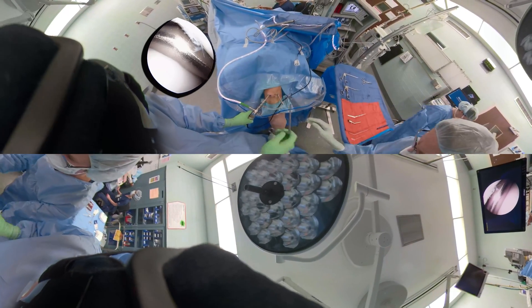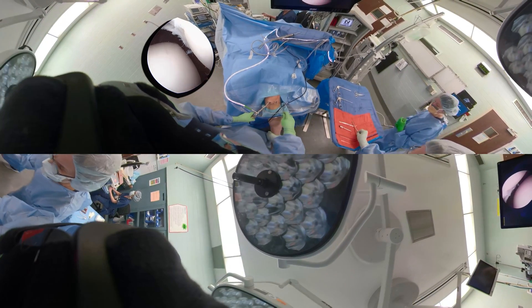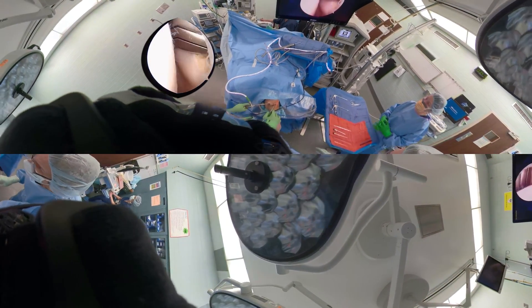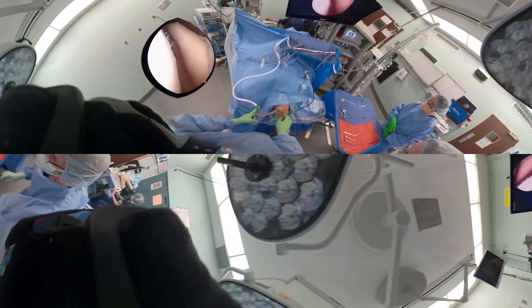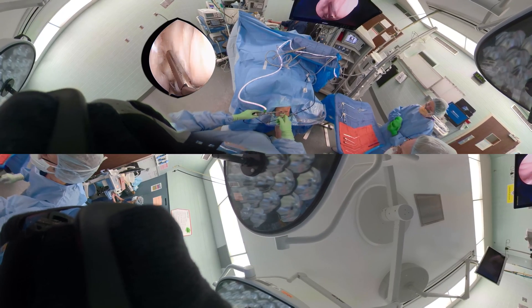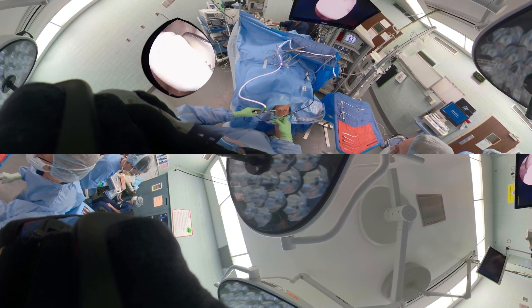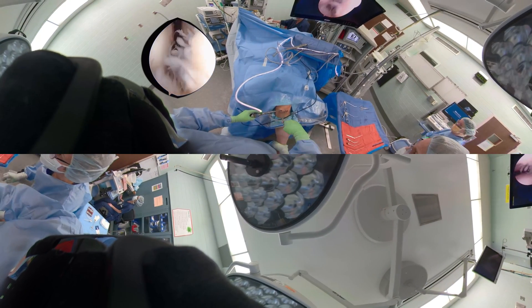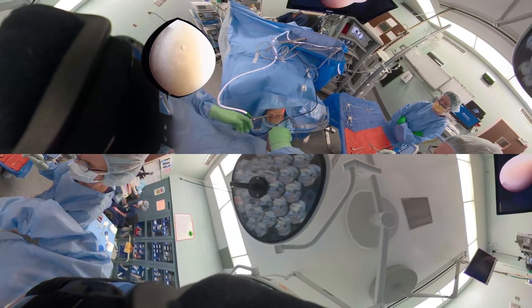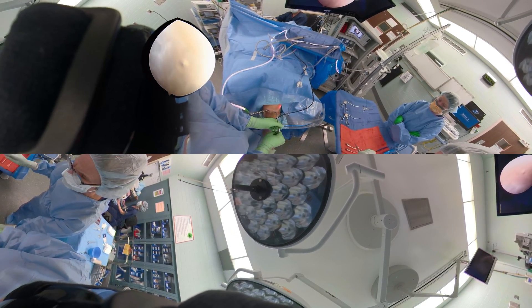If you look at that little V, that's where the scope is looking. We have the instrument — the grasper called a Schlesinger grasper — and we look into the lateral gutter where the loose body is. There are no ratchets on this; open the jaw as wide as possible. Make sure we have a good bite, because if we don't, we can park it in the notch as a backboard and grab it a little better.